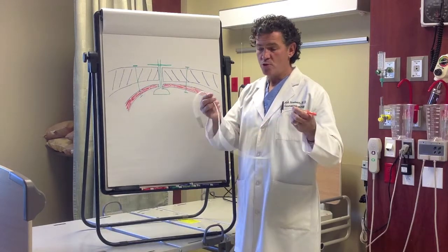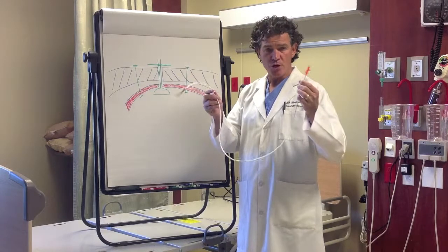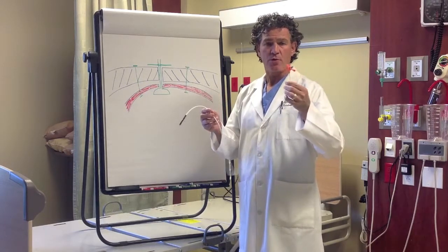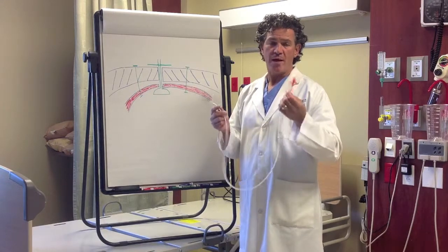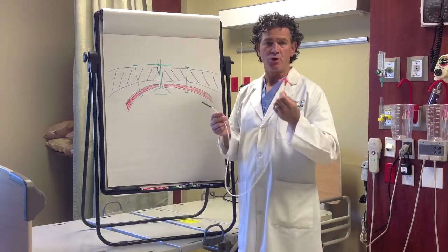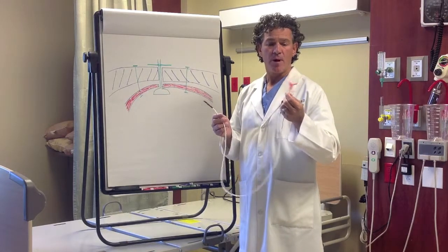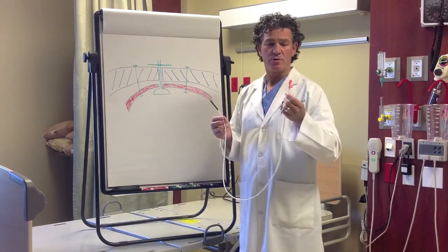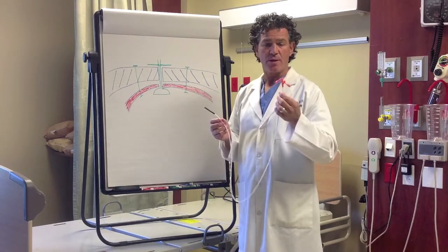So small tubes are designed for small volumes in general. They're not designed to be used for crushed pills, only liquids. And if they're in the small intestines, you can't do bolus feeding. It has to be in a drip or at least a fairly low flow rate. Probably maximum we see up to 125 cc's an hour, and that's aggressive. Any more than that and you start to run into problems.